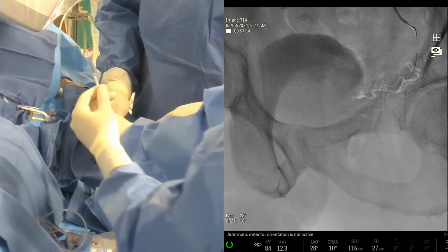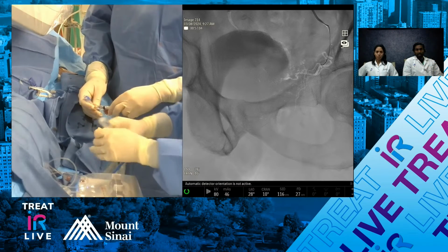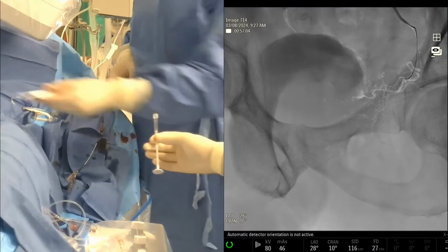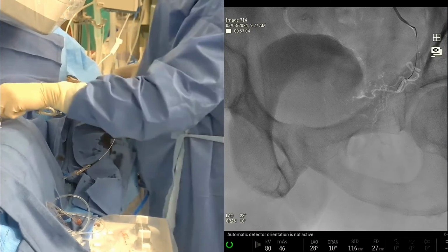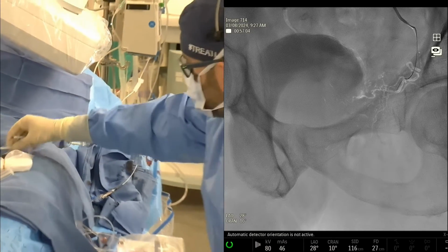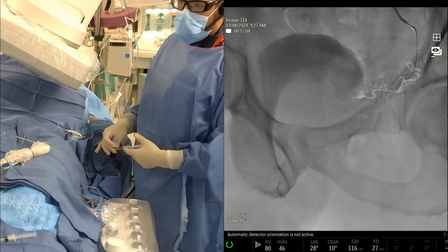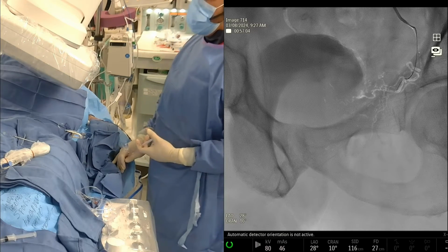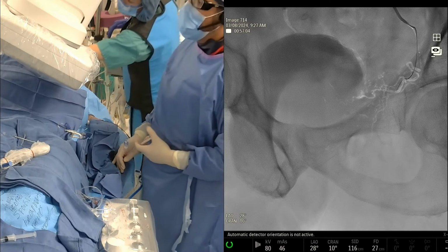And again, what's a good spot for embolization? Well, we want to be as deep as we think we can get. I mean, we don't want to go too far. We're going to do one more angio, then we'll throw it up. The old perfected technique that Carnevale demonstrated: you do proximal first and then distal, but that really only applies to particles. It's not as relevant when you're using a balloon and/or liquid embolic. And so this is another reason why we like this, because it can actually get a proximal and a distal embolization with one injection.